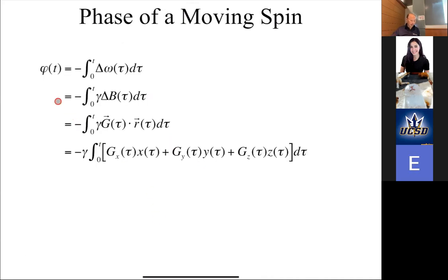It turns out that we can write out an expression for this. It's here, where previously we've looked at, this is what we just had. We've looked at this before. This is our G times position vector. And previously we'd assume that this is just some x naught value. It's just some position, right?